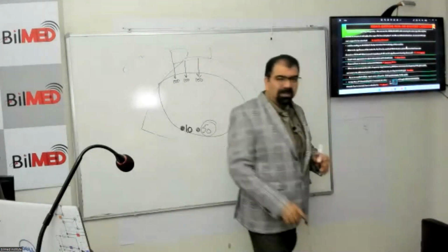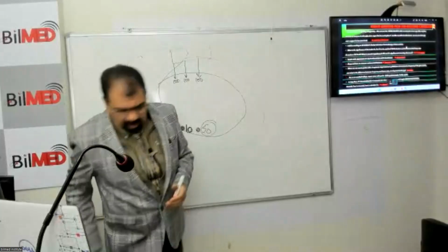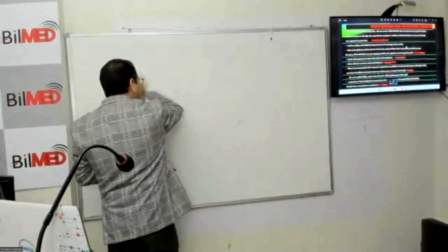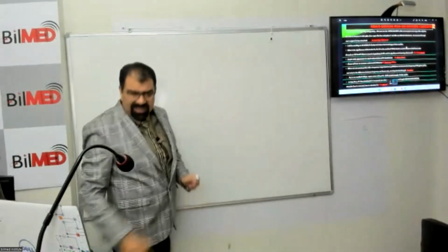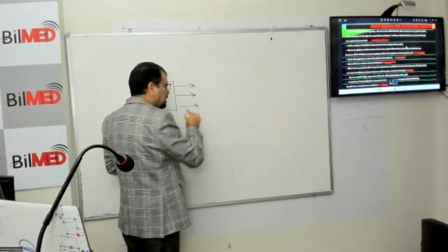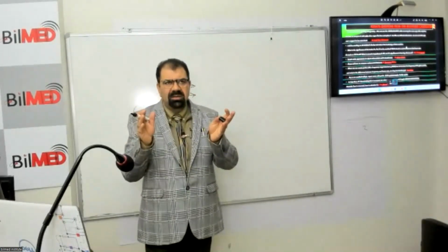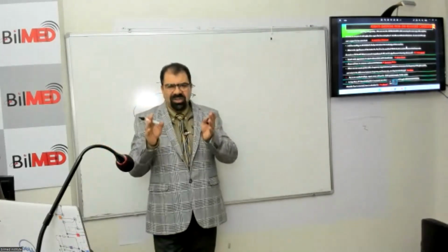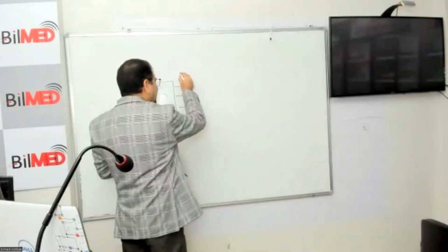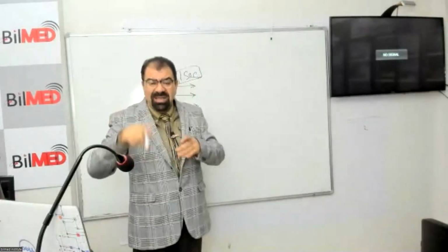PRF. Next point is, what is PRF? PRF is pulse repetition frequency. Pulse repetition frequency means when the machine is sending the beam, now see, the machine is sending the beam. Let's take an example of 100 seconds. Let's calculate it in 100 seconds. If the machine is sending the beam for 1 second, now see, for 1 second, it is listening for 99% of the time.